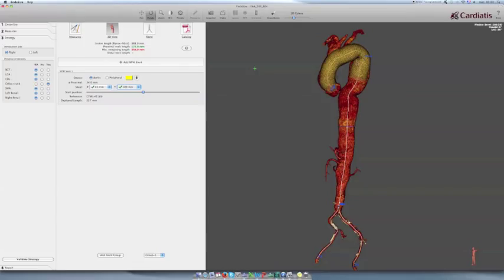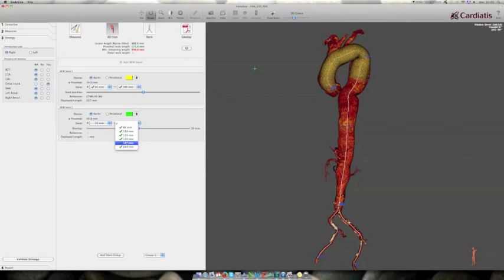In this case, we have to be careful with the curves and the kinks in the aorta. When we add the second MFM, it's very important that it's smaller in diameter, and that it won't be on the curvature, because the overlap, the minimal overlap of 50 millimeters or 5 centimeters, can be changed according to the tortuosity of the aorta or any other specific cases when we need to increase or decrease the overlap.